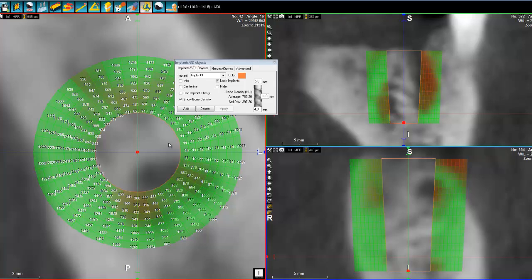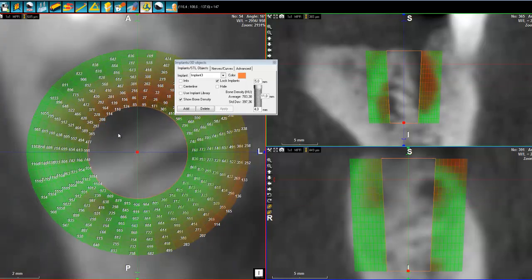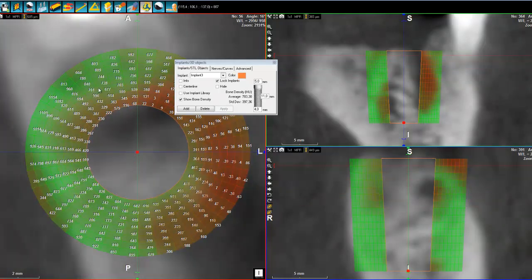This is also a very good tool to check layer after layer that your bone density is quite okay. You can even export this bone density into Excel to make analysis. We already provide averages and standard deviations, giving you the minimum and maximum, and telling you a lot about whether the implant site is sound or not.